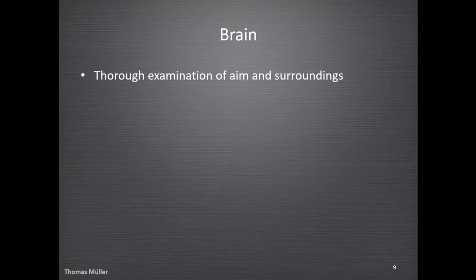What is the most important thing to do with our brain is, first of all, a thorough examination of the aim of our target and of the surroundings. Ultrasound examination before planning a biopsy is mandatory, of course. Where is the target? Can I reach it?